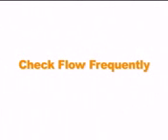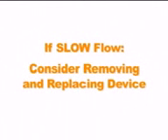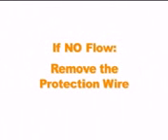Check flow frequently during the procedure. If there is slow flow, consider removing the device and replacing it with a new one. If at any time during the procedure there is no flow, immediately remove the Filter Wire EZ system with the EZ retrieval sheath and replace it with a new device if further intervention is required.